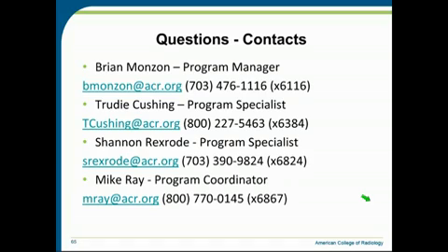I know it's a little more difficult in ARIA, but if there are places that you can utilize comments to put in additional information to meet the standard for what is a complete prescription, I would encourage you to do that. I have gotten a request to talk to the software developers, but I mean, we can show them what we consider a complete prescription should look like, but it's up to them, and I would encourage users to really do the same, to talk to your vendors about the difficulty with prescriptions in ARIA.